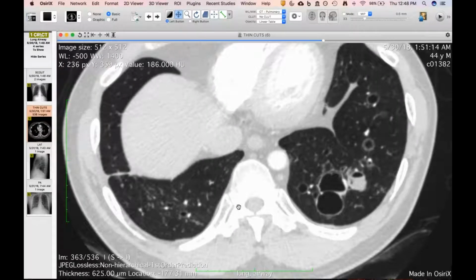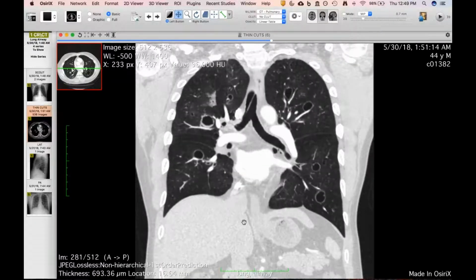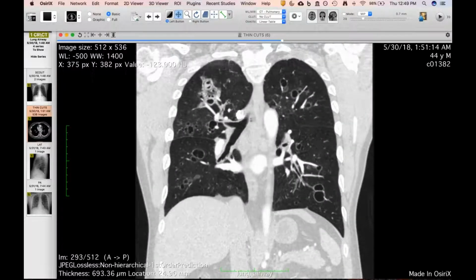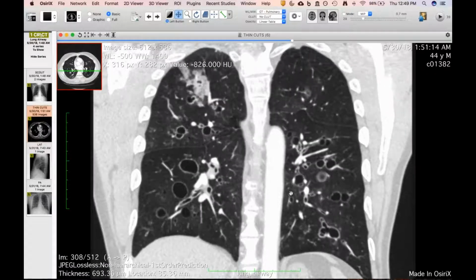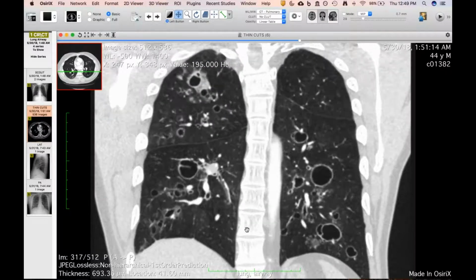Can you give us a coronal on this one? It would sure be nice. Yeah. And so this one, the patient's going to undergo a full bronchiectasis workup. They'll check alpha-1 antitrypsin, even though that's usually more lower lobe, as David, I think, has shown cases of pure bronchiectasis in that. But I think that's kind of the working diagnosis at this point.